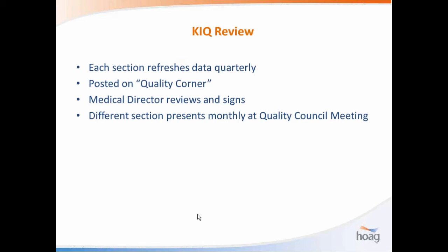So for KIQs, after we select what each section is going to be monitoring for KIQ, they refresh their data on a quarterly basis, and they post it on a bulletin board that we cutely named the Quality Corner, and the medical director reviews and signs all of them. And then we have a different section present their data monthly at our Quality Council meeting.